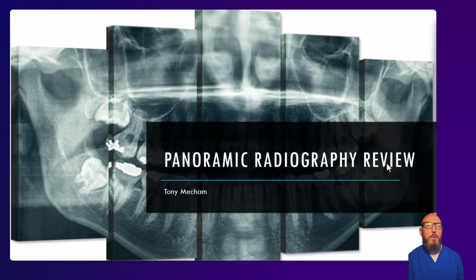This is the third video in the anatomy review series, and this is just a quick panoramic review. Same drill as before, you've had pano in your first year course, DMD 5340. I'm not going to reteach geometry, focal trough, physics of magnification and distortion. You've had all that. So if any of this feels unfamiliar, that's your cue to go back to the first year material before continuing in this course. It's foundational for clinical interpretation.